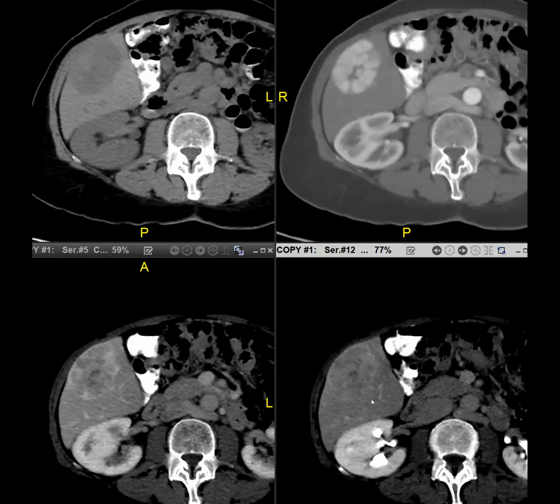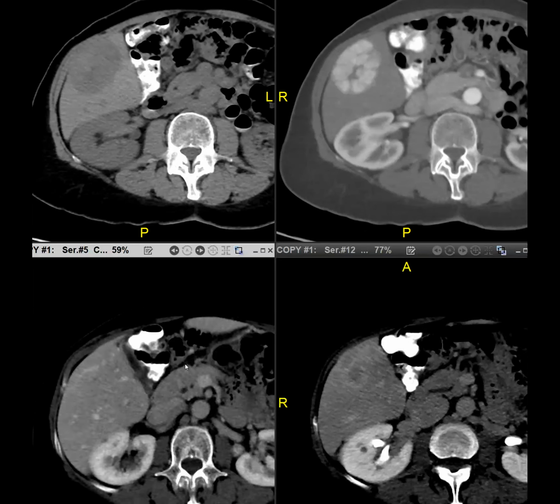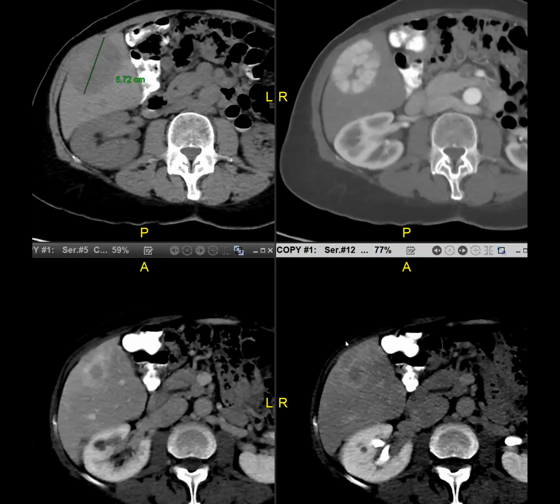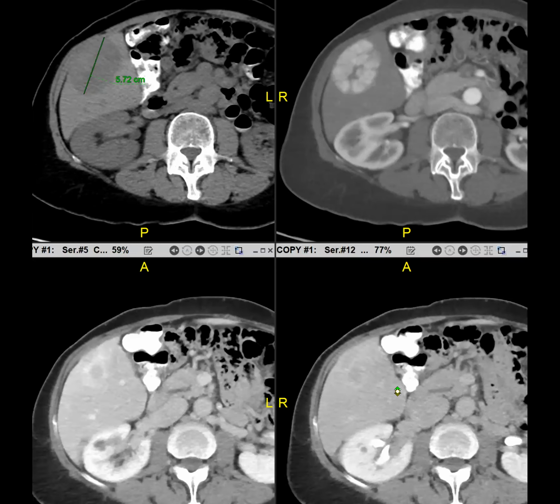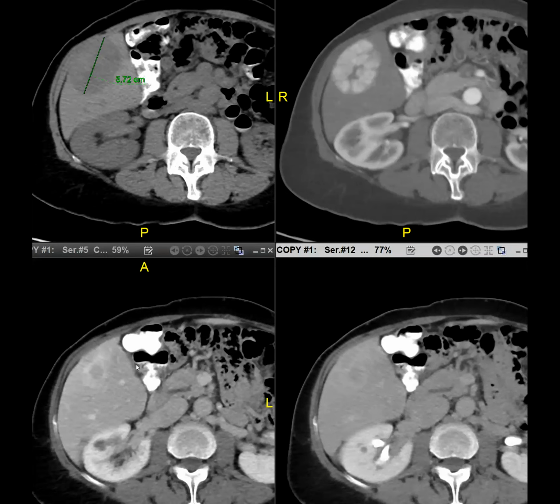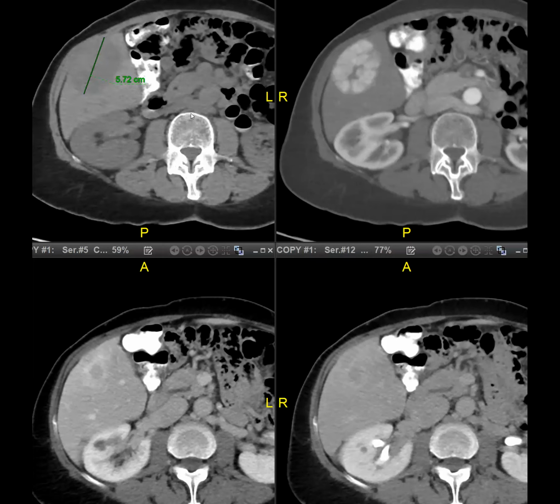I think this is a great case for liver windows too. Victoria, put them back on your normal windows, like you had at the beginning. Put the pre on the normal window. Oh, yes, it is the normal window. Okay, I see your point. It's definitely lower and there's some washout. But I feel like there's a lot of retention on the delayed, but point taken.